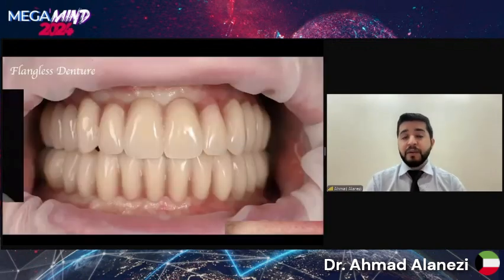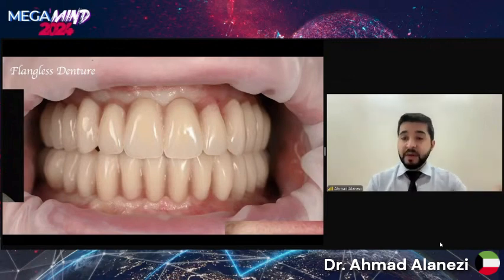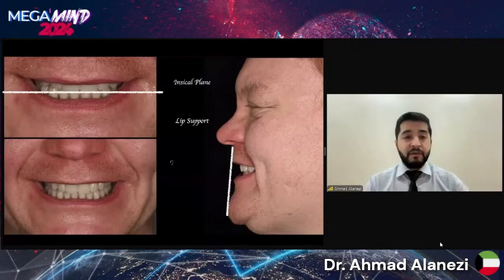And we wanted to know the incisal plane, you want to evaluate the lip support, the teeth display and the buccal corridor. And once we are happy with this, we can take those dentures and put them in a dual scan protocol, as discussed earlier by our previous colleague.